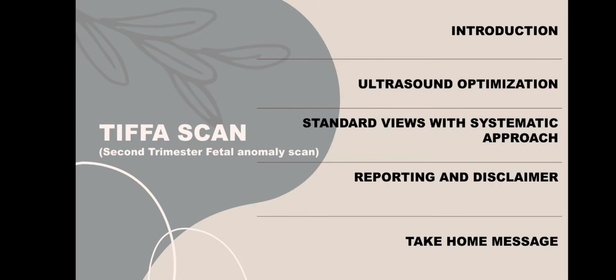Most missed anomalies occur not because of a lack of sonological knowledge, but because an anatomical structure was never examined. Therefore, throughout this lecture, we will repeatedly return to one concept: never scan randomly, always scan systematically. We shall begin with ultrasound optimization, then the ISUOG checklist, then standard image planes, image quality criteria, practical scanning tips, common mistakes, impression and disclaimers.